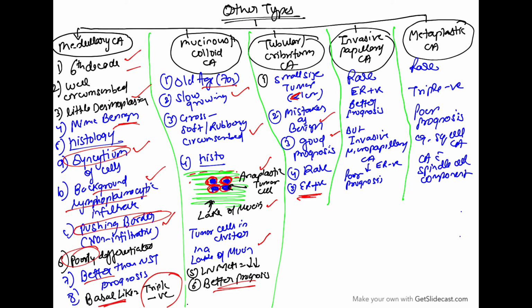Next is invasive papillary carcinoma. It's a very rare carcinoma. It's ER positive. It has a better prognosis. But the invasive micropapillary carcinoma is ER negative and it has a poor prognosis.